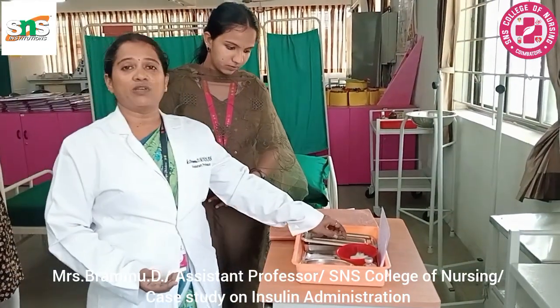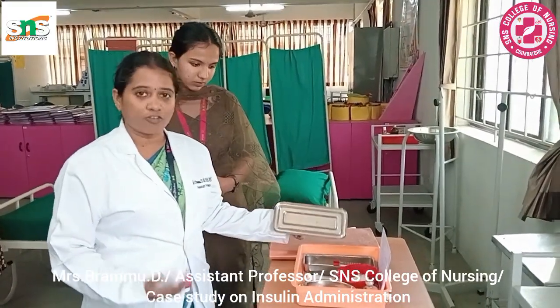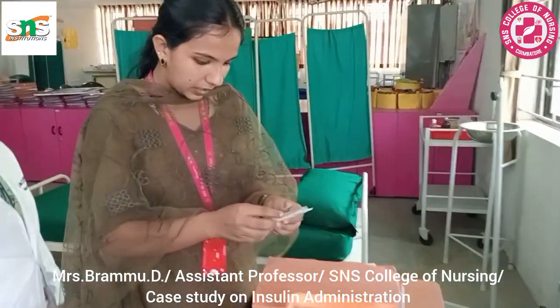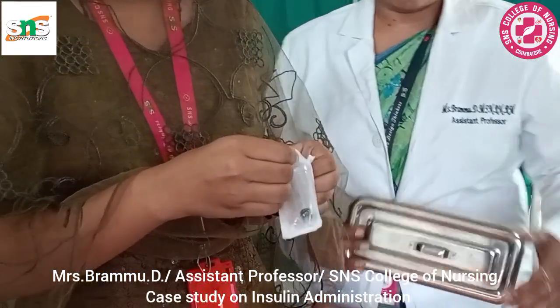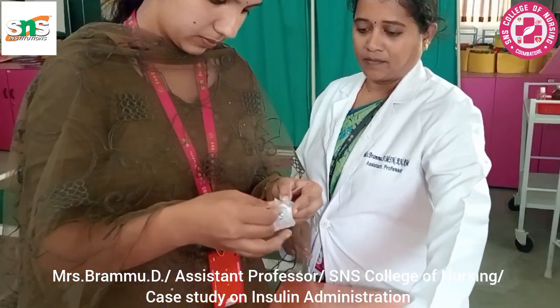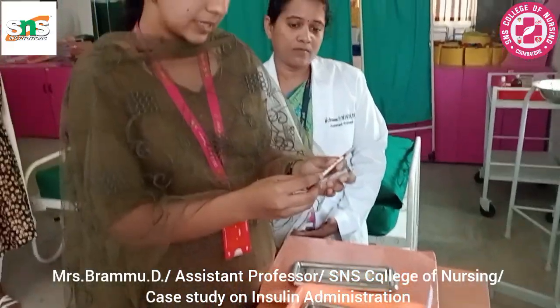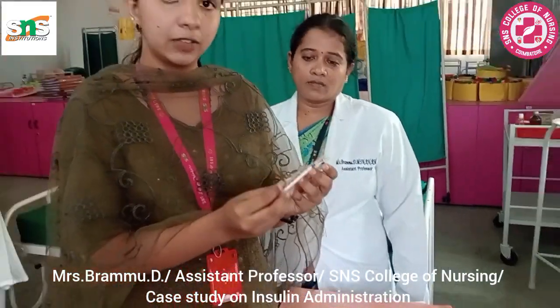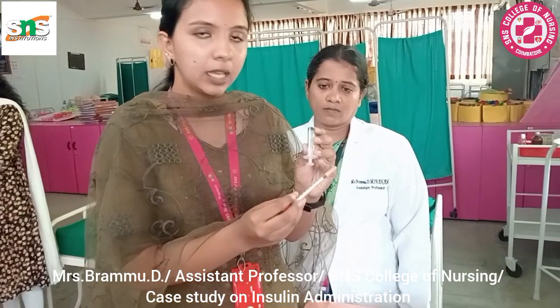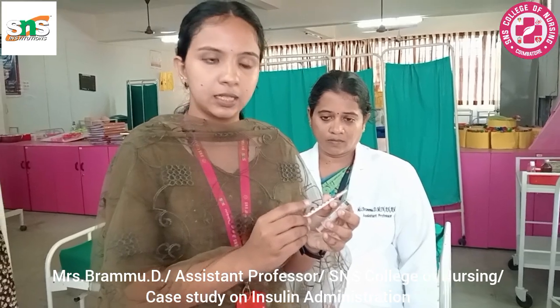She will be telling the difference between a normal syringe and an insulin syringe. Let us see in detail a little closer. In a normal syringe, it is given in ml, whereas in an insulin syringe, it is given in units. So compared to ml, we cannot directly load medications through this normal syringe. We can only directly administer insulin through this insulin syringe.